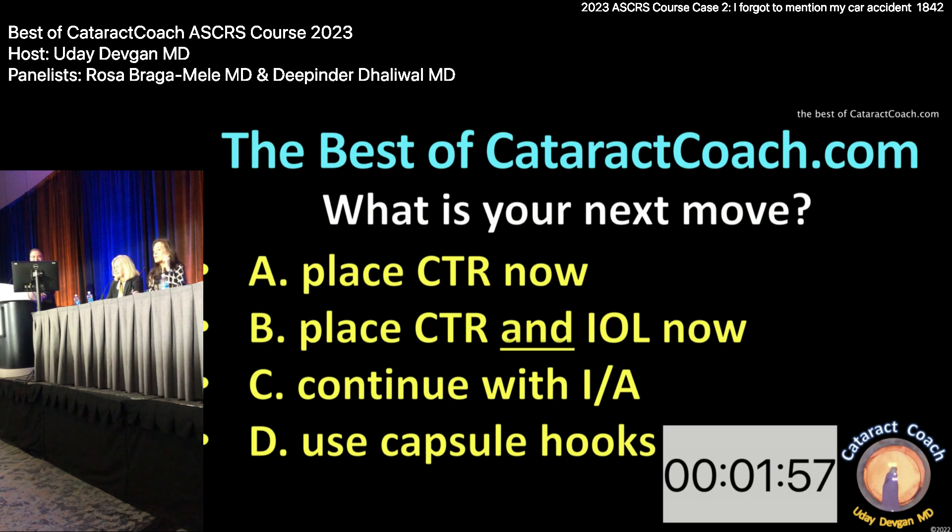When you put the viscoelastic in, go just under the anterior capsule to dissect the cortex out as you do that — or go right on the posterior capsule and dissect the other way, but I feel like it's easier going to the anterior. Are you going to place the CTR now, or finish getting the cortex first? I can put a CTR in now. CTR and the lens — probably do both.